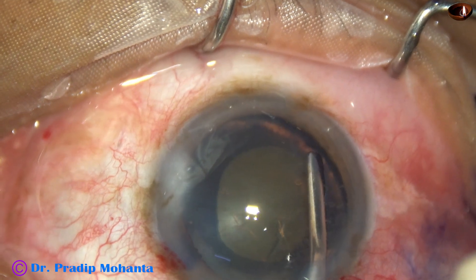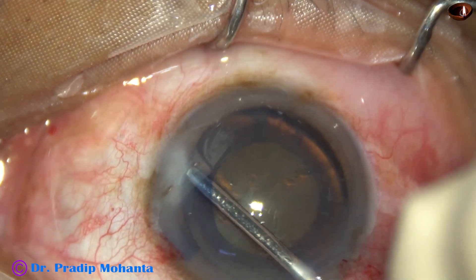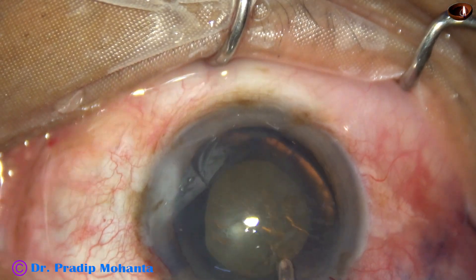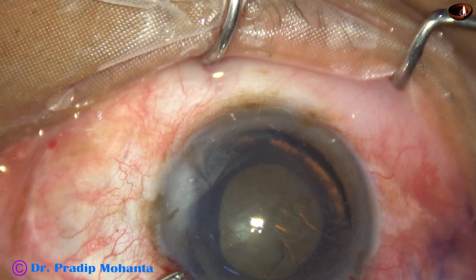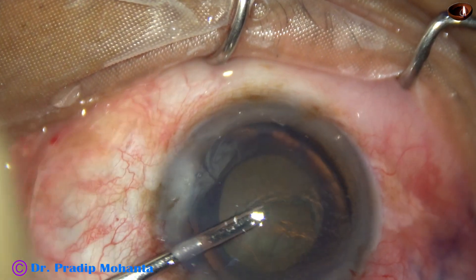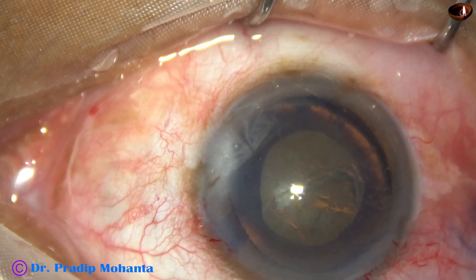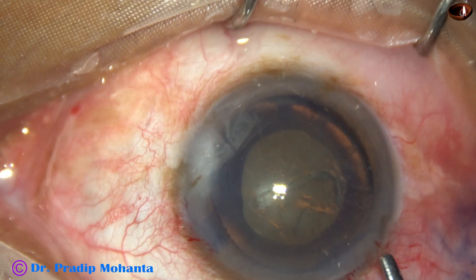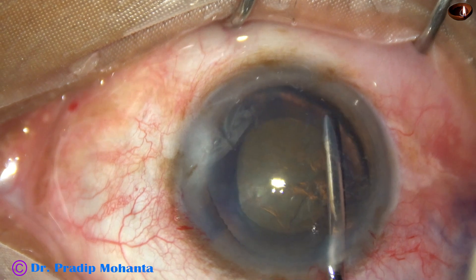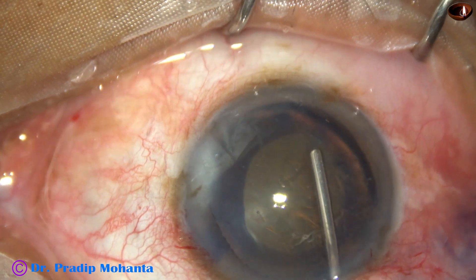Why? Because if we do hydrodissection, the cortical matter will come out of the capsular bag and visibility will be poor. My plan is to do hydro-free dissection — separation of the capsule from the cortex — to create a space for introduction of the CTR. The cortex and lens matter do not come out of the capsular bag, but space is created for placement of the CTR.